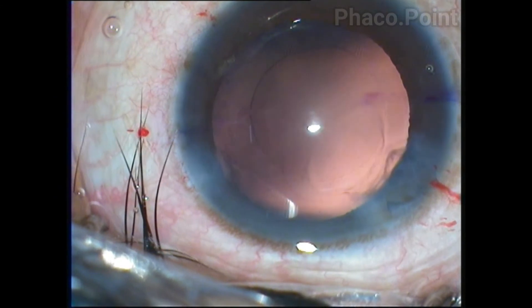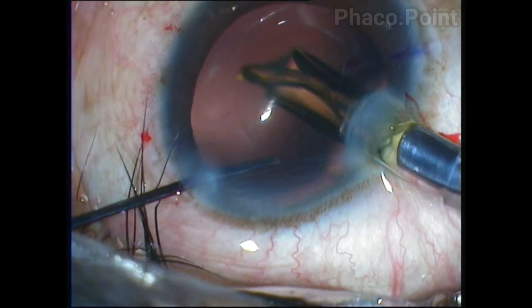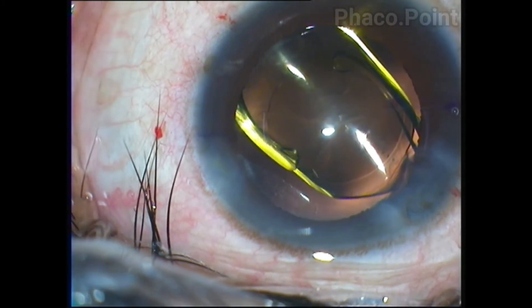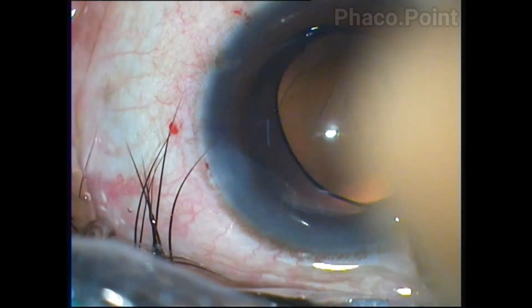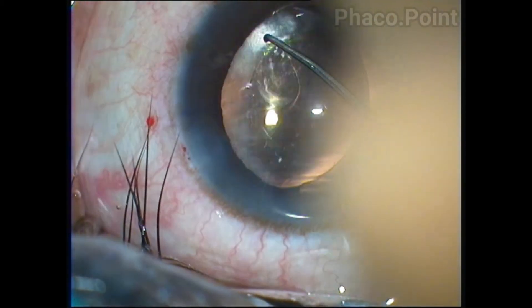Once you have adequately enhanced the visibility of the corneal marking, you can go ahead with the implantation of the toric intraocular lens. After implantation, the toric lens is then rotated until it comes to lie within 5 degrees from the intended axis of placement.